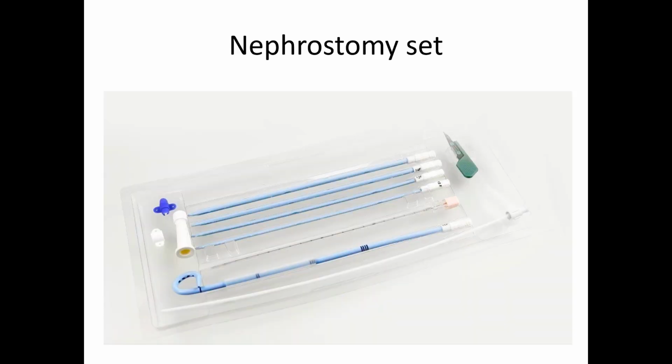This is a nephrostomy tube, and you should have a guide wire, which is not shown clearly. It's a nephrostomy.